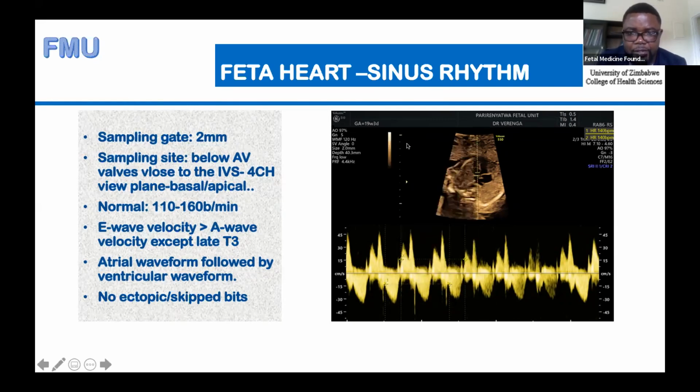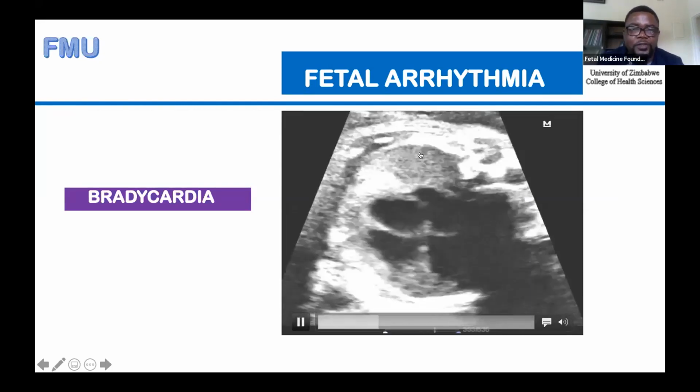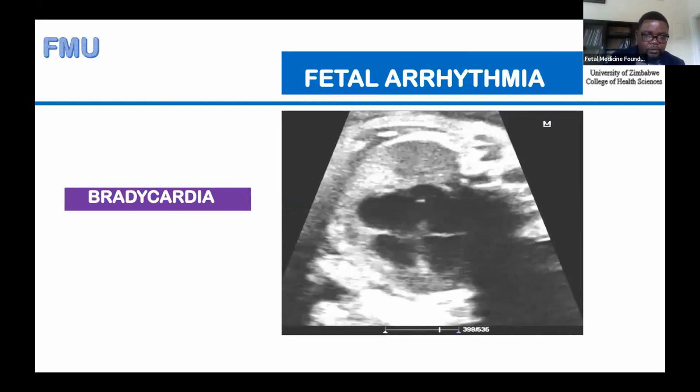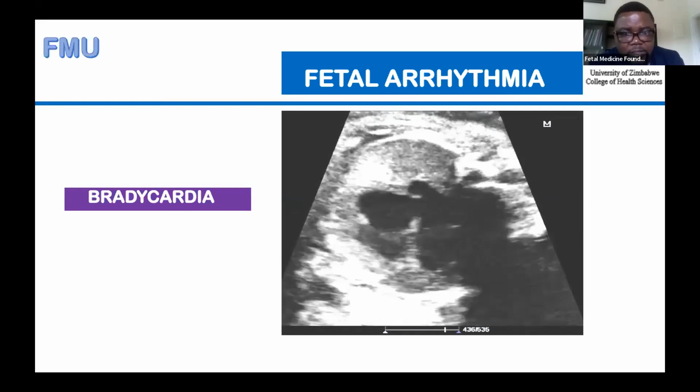I'll move on to the next. This is just to show you some of the fetal arrhythmia. This is a case of fetal bradycardia. There's no slowing of the video here. The way the heart is beating is how it was beating.